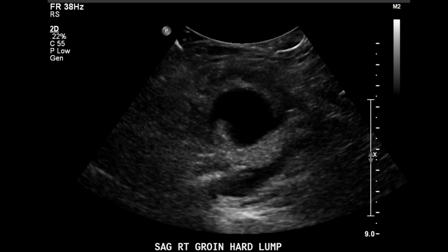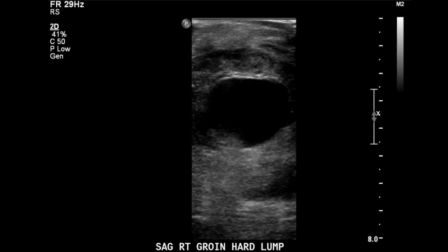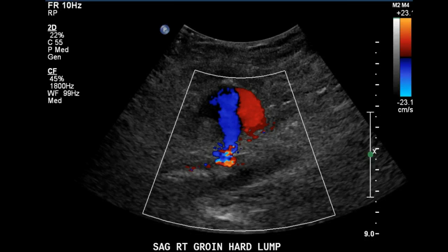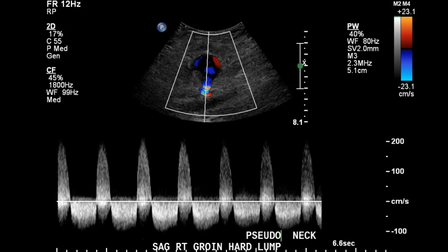The next few images represent diameter measurements of the PSA. This is important because these measurements are used for comparison to previous or subsequent studies. Here is flow from the neck and into the PSA, followed by more measurements, and again flow at the neck, which is the connection between the artery and the pseudoaneurysm.